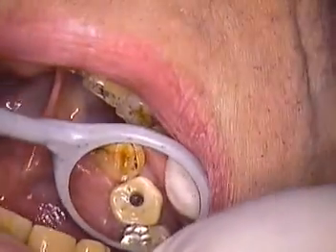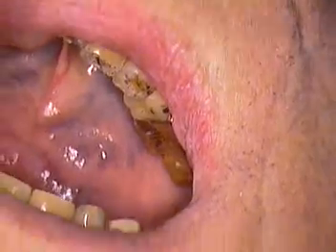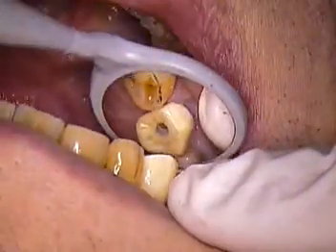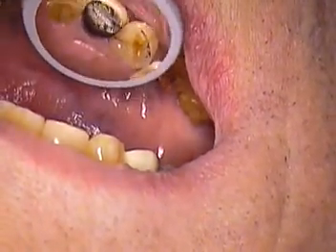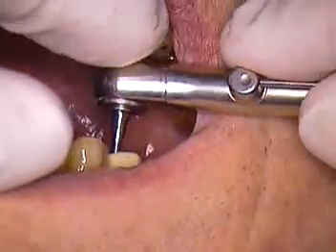We're back here now getting ready to torque this tooth down. It did take us a little while to get this adjusted, both mesial and distal contacts, and we are just a little lighter than his own teeth. But at this point Rich doesn't mind the new look, so we're going to go ahead and get that torqued down to 35 newton centimeters.